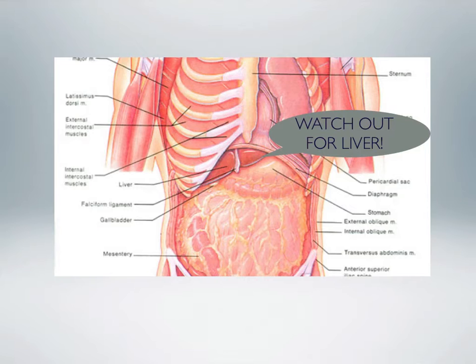We're not in Tamale, Africa, but the bleeding issue is the big one in the U.S. If I had somebody in DIC, somebody who was on Coumadin and you were afraid they bled into their heart, someone who has a bleeding diathesis, I would probably go parasternal. But the information on that, in my opinion, is purely anecdotal. I don't know of any major reports showing complications by going through the liver.